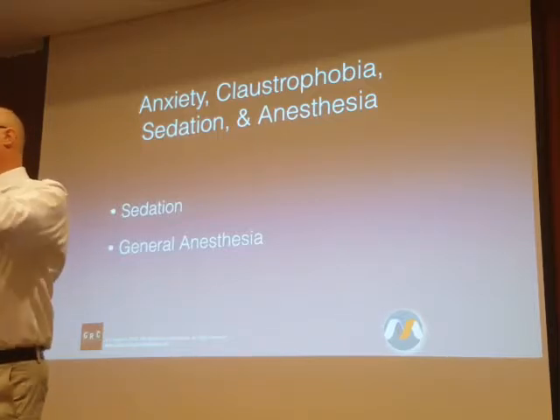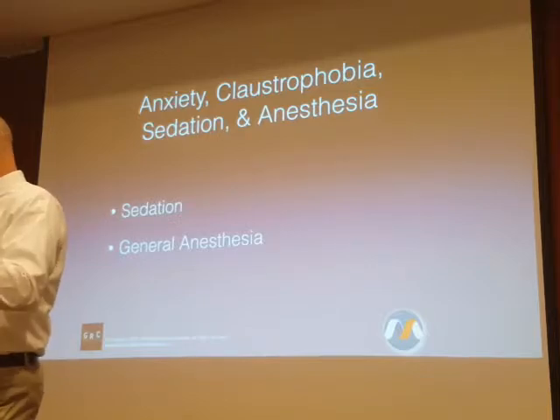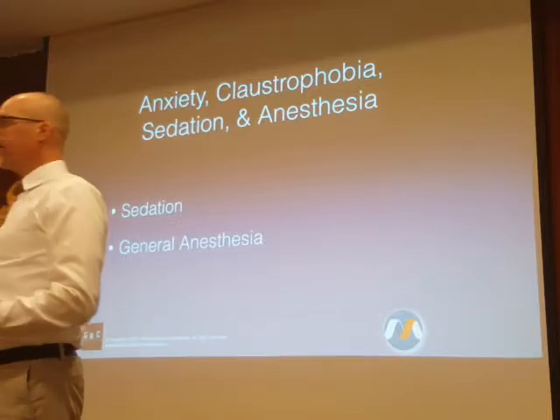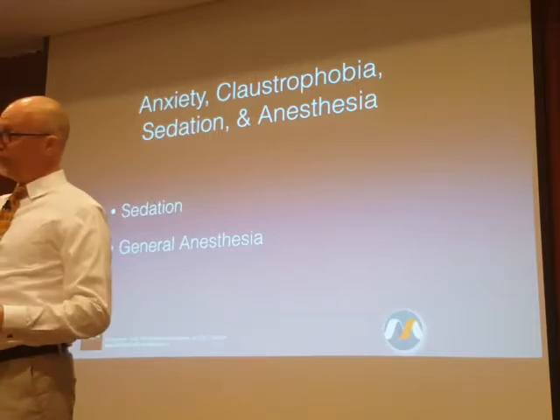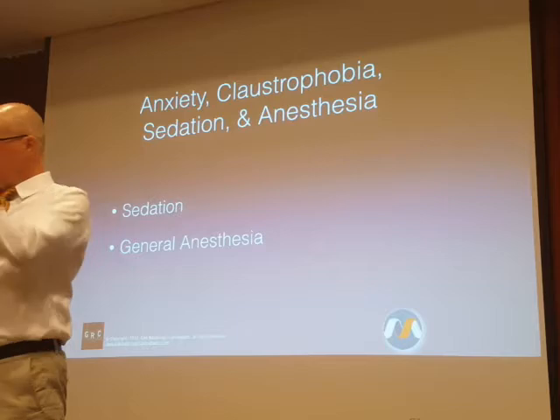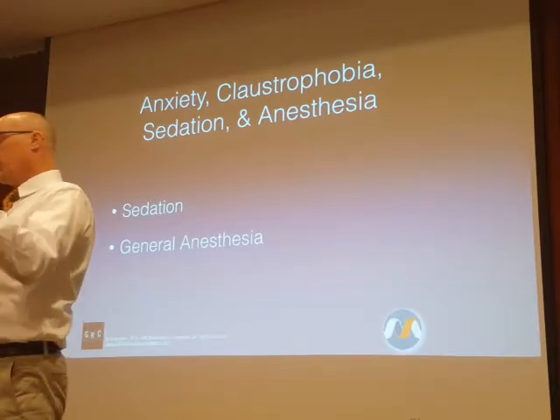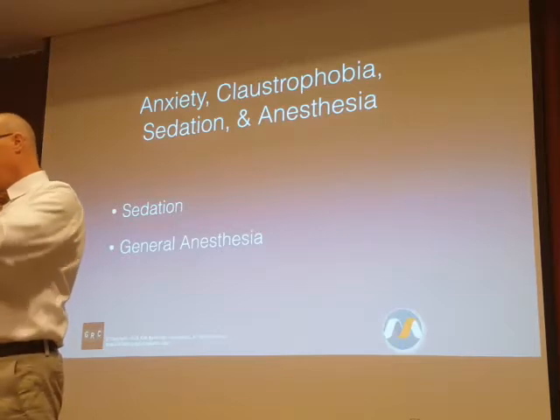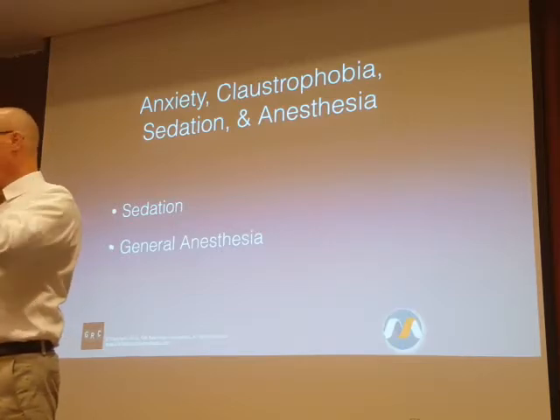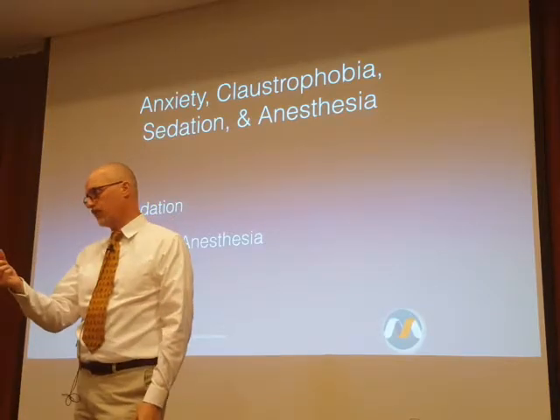One of the leads is going to flow down the aorta into the patient's heart. So that lead that's floating in the aorta is getting a constant bath of moving blood flow across it. And so any heating that it experiences along the length of it is going to be easily transmitted into this moving fluid heat sink. The heat exchange will be fairly efficient across that boundary.